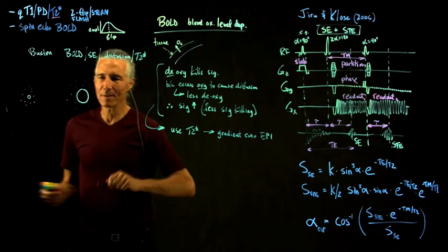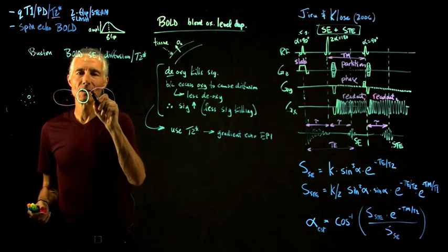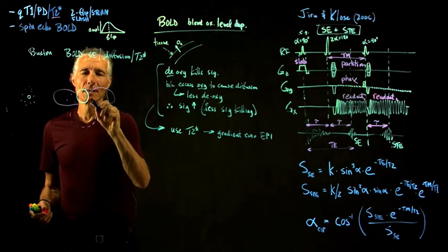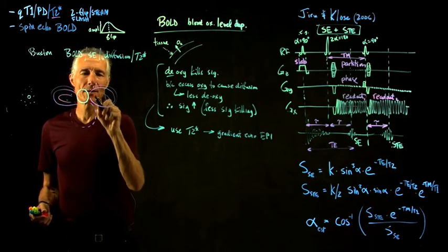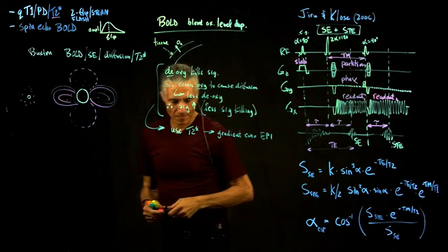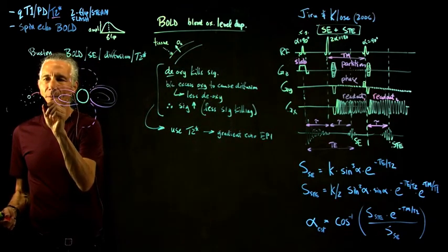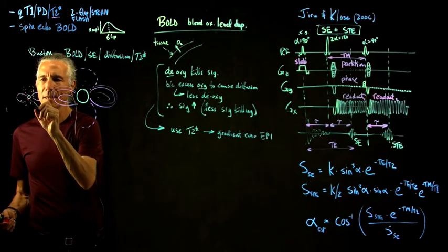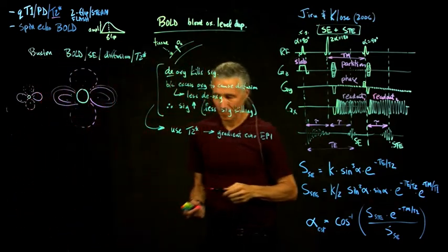So let's say we've got a bunch of magnetized blood in that large vessel. What's going to happen is it will make a kind of a cloverleaf pattern of magnetic field around the blood vessel. And the same thing will happen around a small blood vessel. So we have this kind of positive and negative cloverleaf pattern of the magnetic field around the blood vessel.